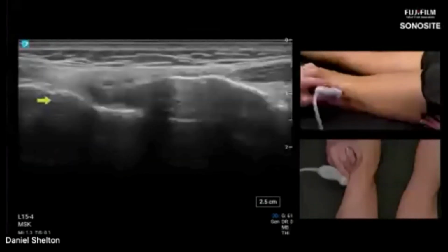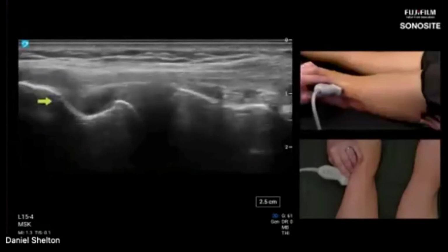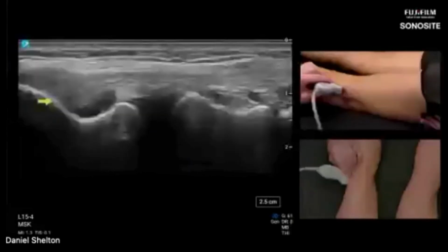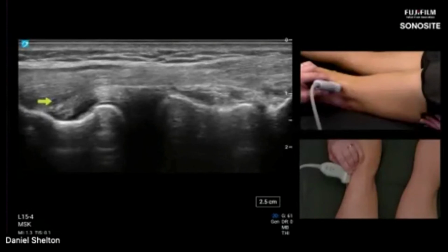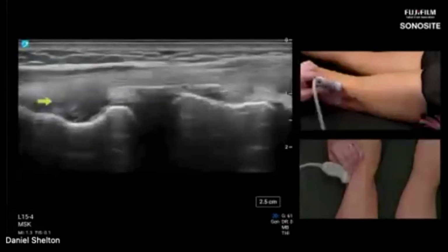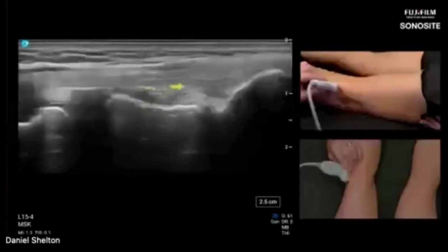Just as a quick review of the lateral structures, because we left off here and I said we would go trek into the posterior biceps femoris area on the last webinar. And I mentioned that we would do that on the posterior knee because that biceps femoris is a bit more of a posterior lateral structure. So what I'm going to do now is, here's the proximal LCL, follow it distally, distally, distally.